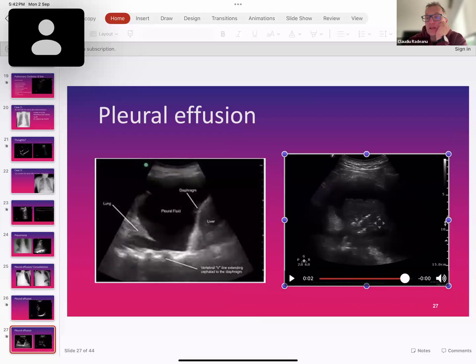This is lung, coming back, subcutaneous tissue, muscles. You will have ribs sitting on the side, and then underneath you have this black, hypoechoic fluid. This is lung, and the white part that you see is some bronchiola and airways, part of the airways as well.